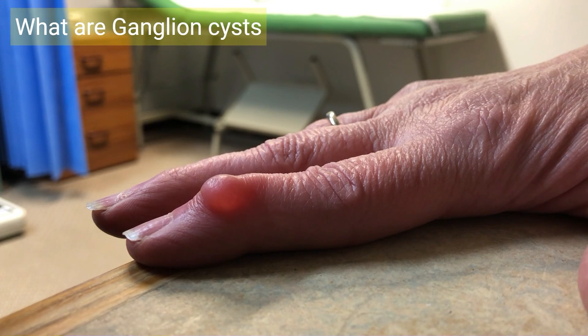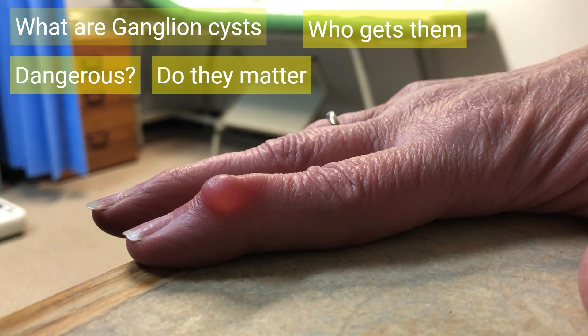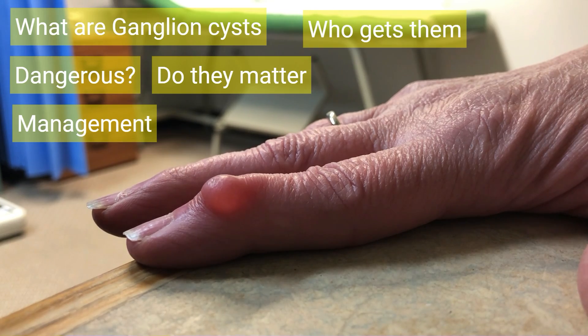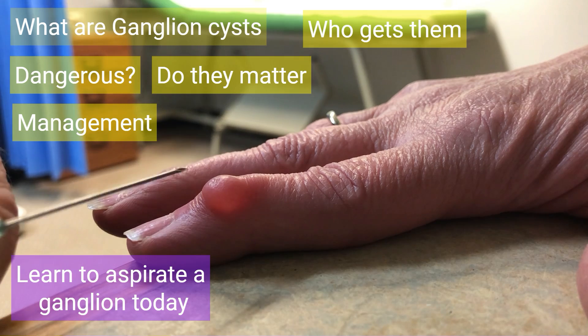What are ganglion cysts? Who gets them? Are they dangerous? Do they matter? How should we manage them in primary care? If you've never aspirated a ganglion before, I'm going to teach you how.